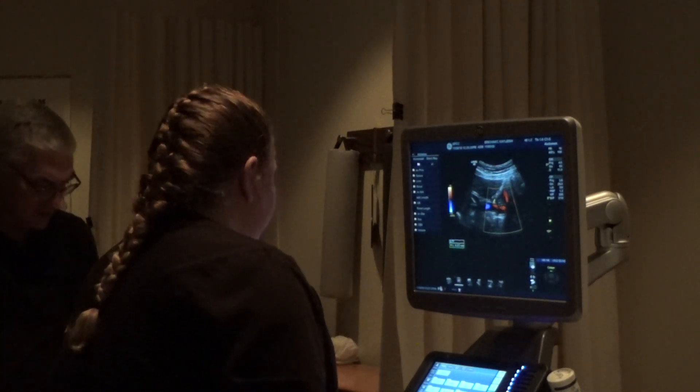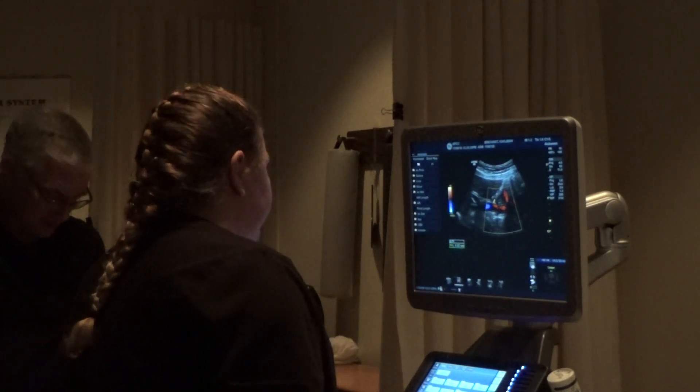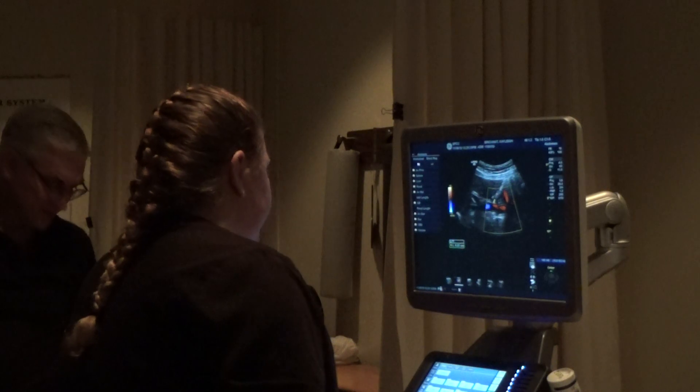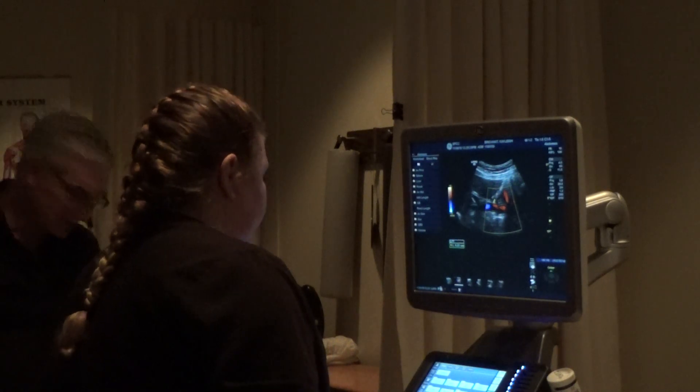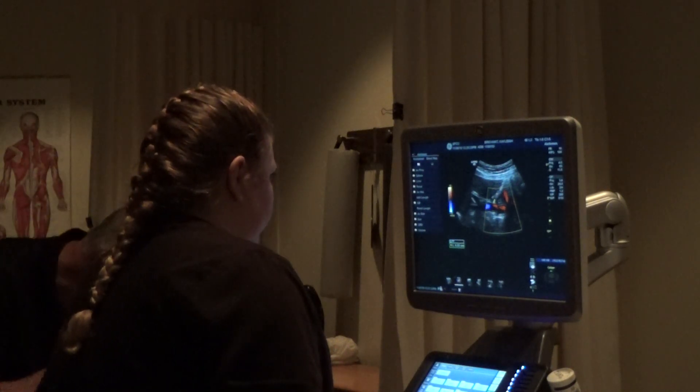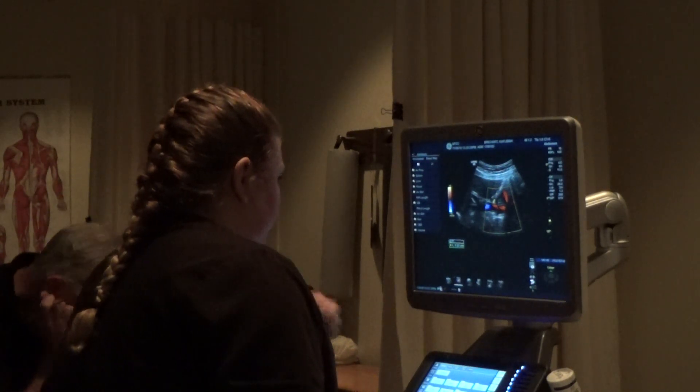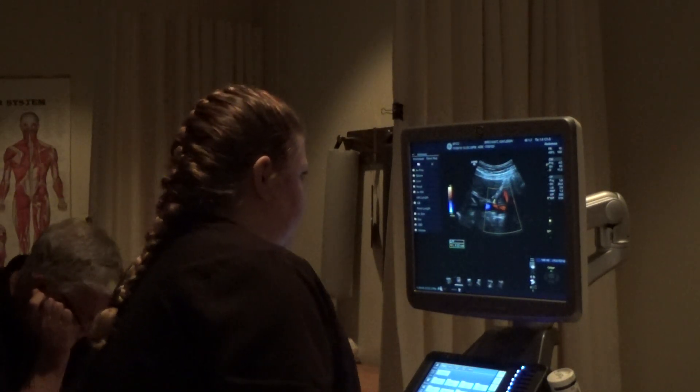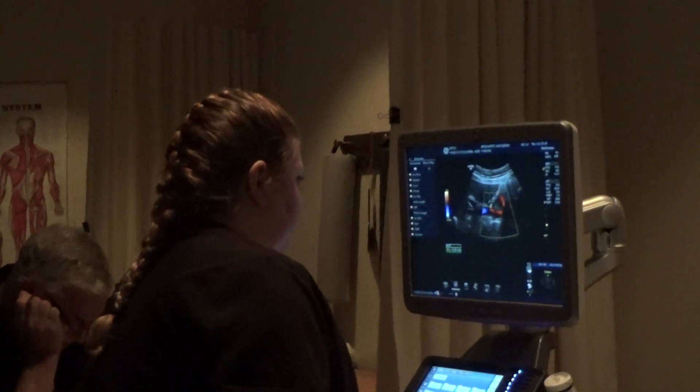That's all the standard questions. Now I want you to see if you can show me the left renal vein.